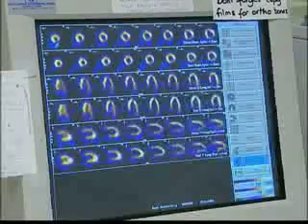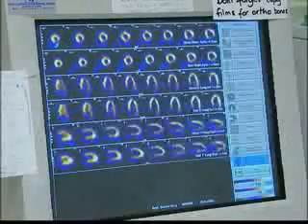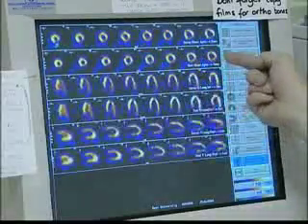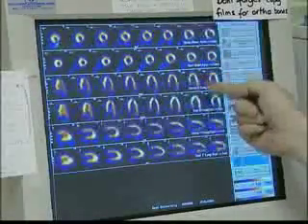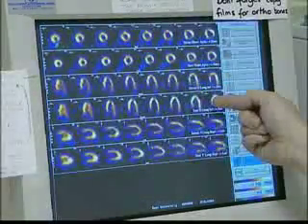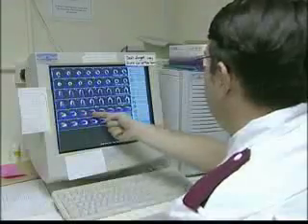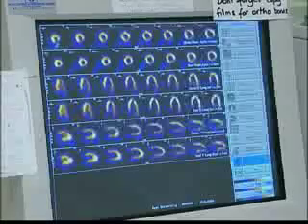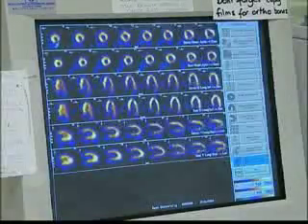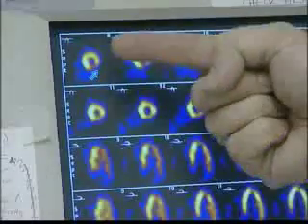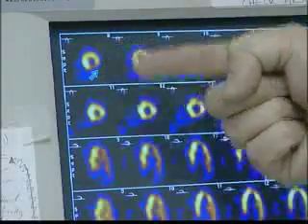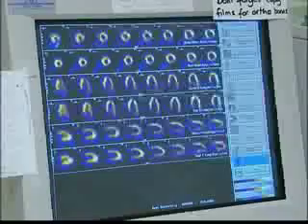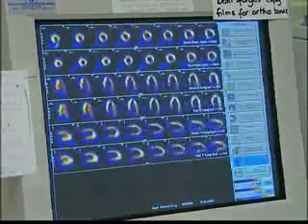Here we have some processed images. We're looking at the stress and rest in the short axis, stress and rest in the horizontal long axis, and stress and rest in the vertical long axis. What we're now going to do is compare isotope distribution in the stress images and the rest images, looking for reversible or irreversible defects.